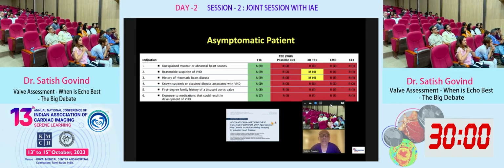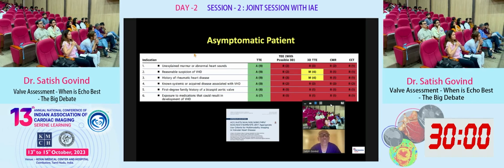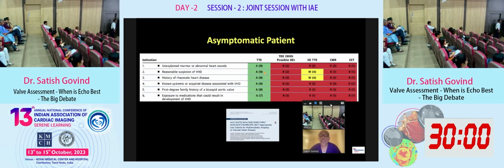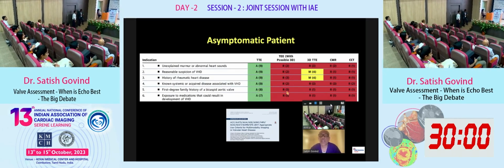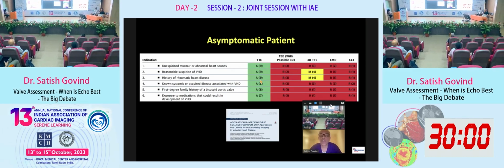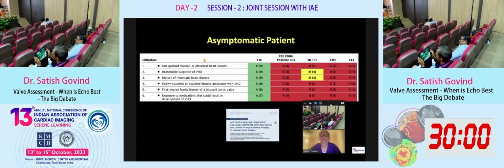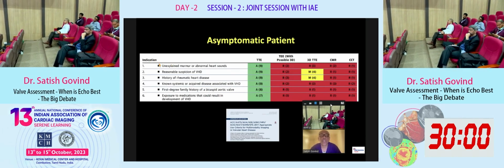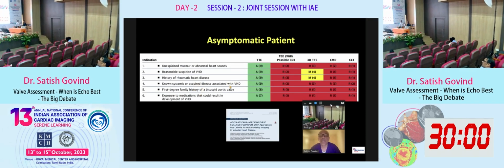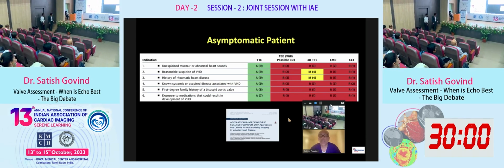So it's a very busy slide, and I'll be continuing to show these very colorful slides. Since it's so busy, just to make it very clear as to how you can look at it, just ignore those small alphabets over there. Green means it is appropriate, red is rarely used, and then you have the M, which is yellow, which is the mid one. So anything green is good, red is not so good, and the M yellow is in the middle. Now, the use of echo starts from the asymptomatic patient itself. So you can look at the indications here. Many times just clinical suspicions, features, signs, or any other family history is enough to initiate echo. So echo is the appropriate tool starting from the asymptomatic patients here.